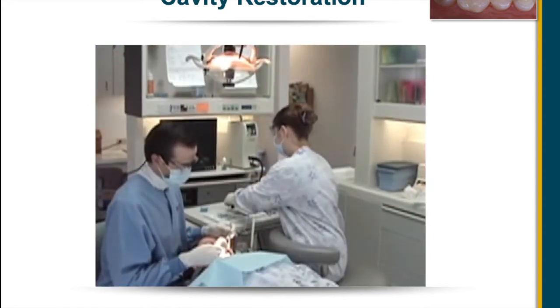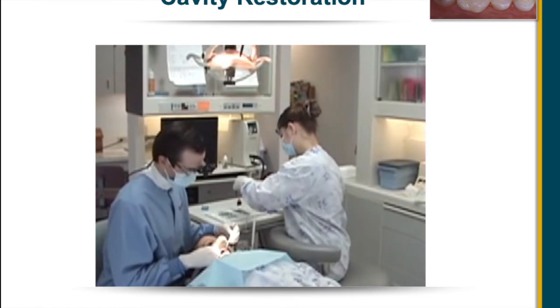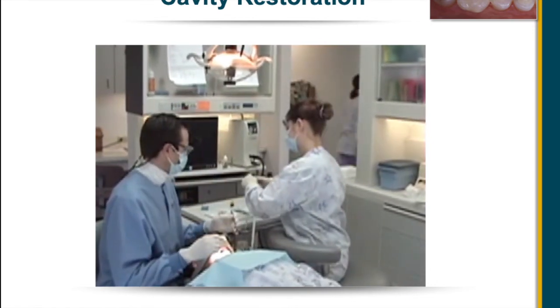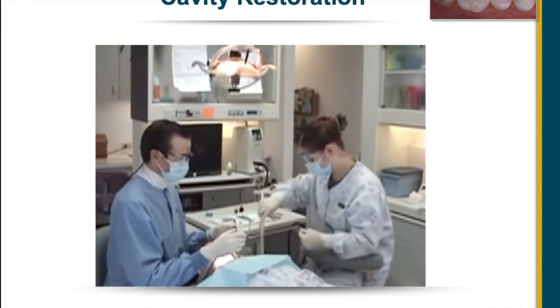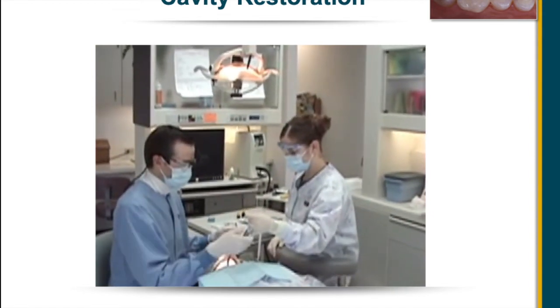I just want you to note the position of the assistant's body. She's working on the assistant's bracket table and preparing the bonding and the priming material. She then presents the instruments to the doctor.